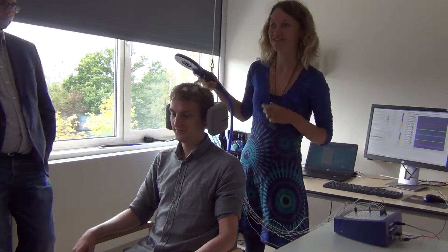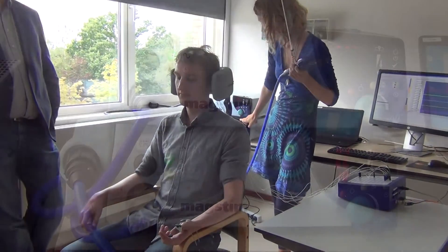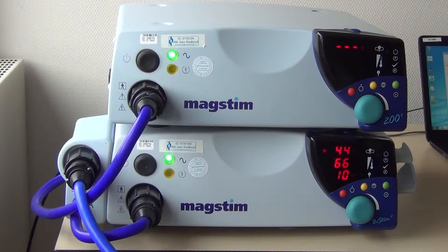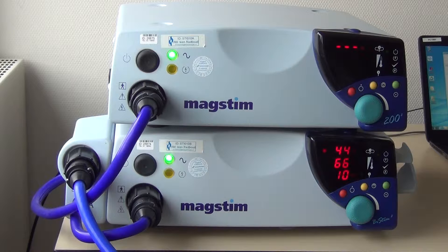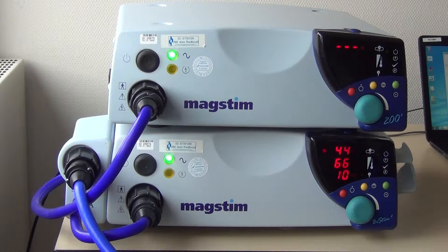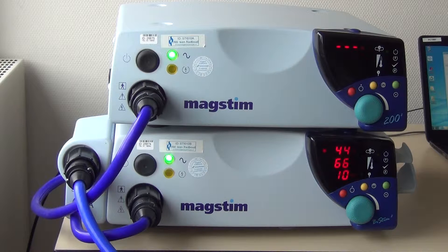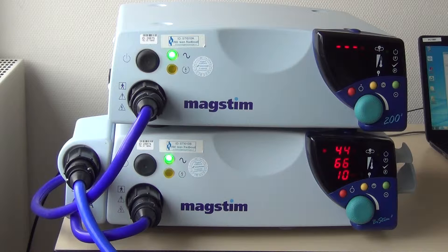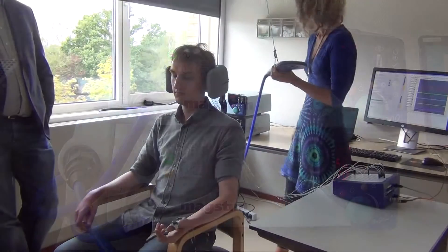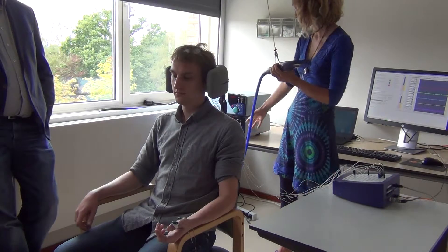Back to the TMS device: you see three numbers. It's a stimulus intensity — a percentage of the maximum output that the device can give. This is for the first device, so for the first pulse; the second is for the second pulse; and this is the time between the stimuli. You can give just one pulse if you put this on zero, but we have a couple of long protocols, so it's a lot of work to adjust this manually all the time.